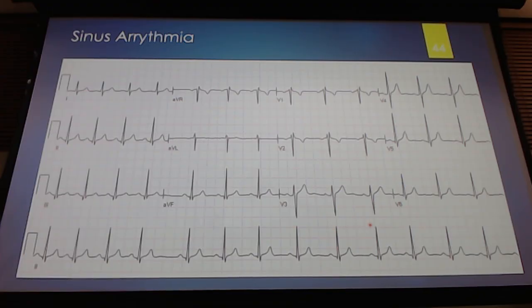Okay, maybe, so if we march these out, we can see that here it looks like it's a little irregular, a little spot here. We still got PQST, we still got PQST. Okay, our rate seems to be okay. Why do we have a little bit of a change here when we march this stuff out?